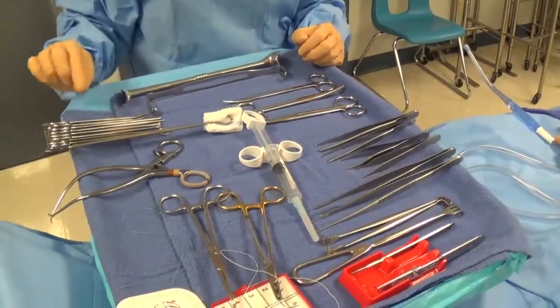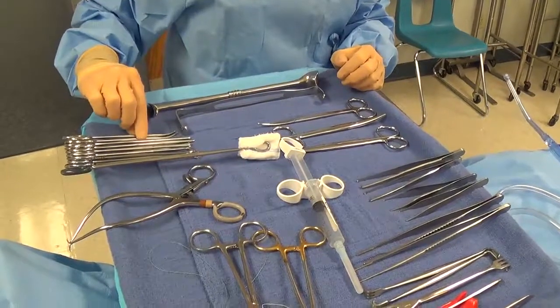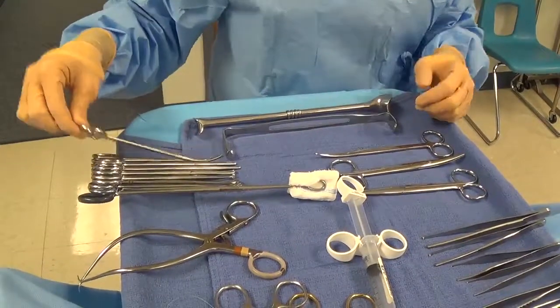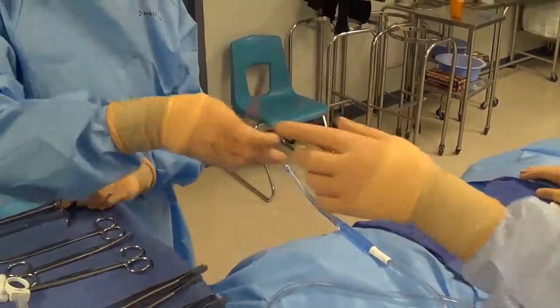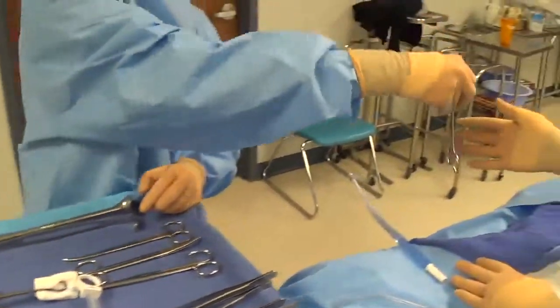Another issue is what we call instrument transfers. When you pick up an instrument you want to grab it where it's going to be handed from, rather than grabbing it somewhere else on the instrument, which would cause an instrument transfer before it comes up to the field. We want to make sure that you touch it once — if you have it in your hand, go ahead and hand it up to the field.